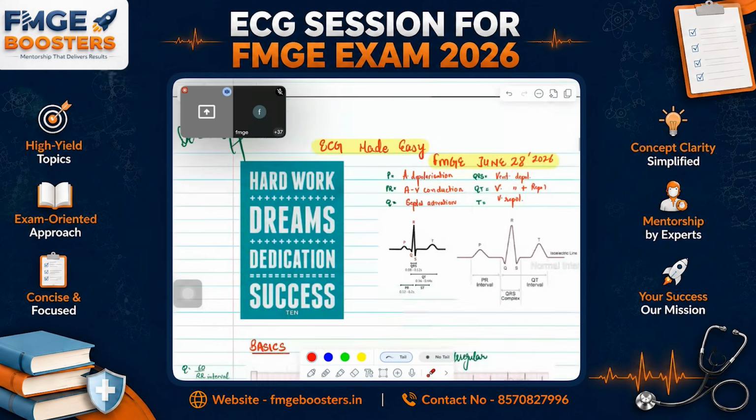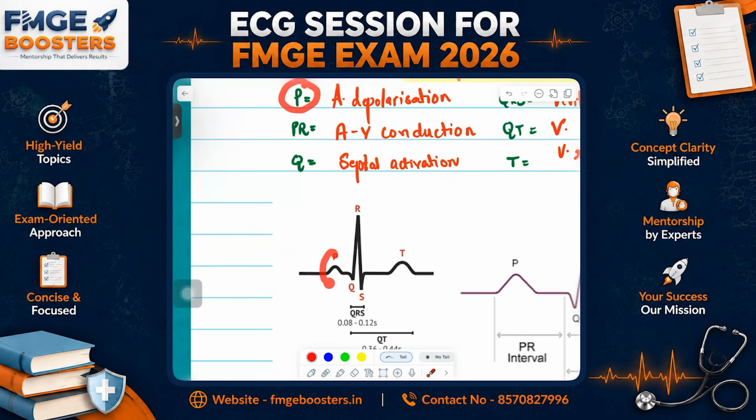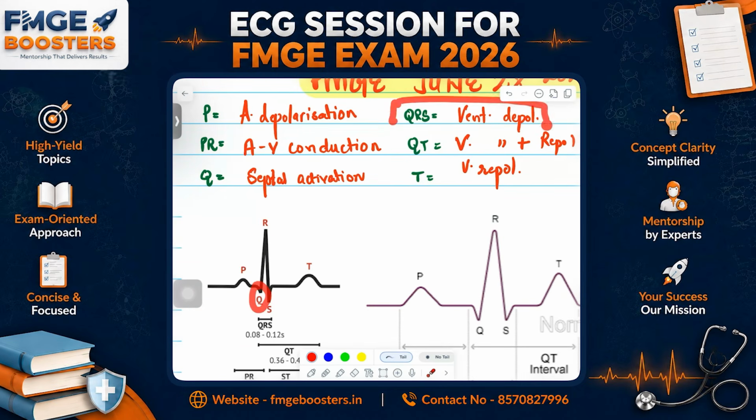So the very first thing we're going to start with is the basics. The P wave tells us about atrial depolarization. The PR interval tells us about atrioventricular conduction, which is from here till here, right? Then the Q wave tells us about septal depolarization, whereas the complete QRS complex tells us about ventricular depolarization. And the T wave tells us about ventricular repolarization.